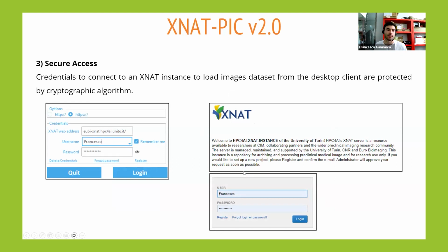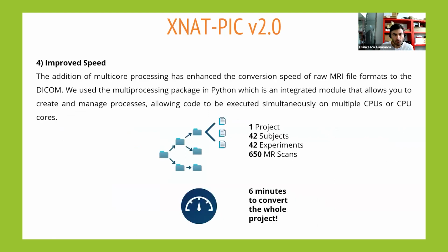The credentials, such as the IP, the username, and the password to connect to an XNAT instance, are protected by a cryptographic algorithm. The figure on the right shows you our XNAT instance called Euro-BioImaging.